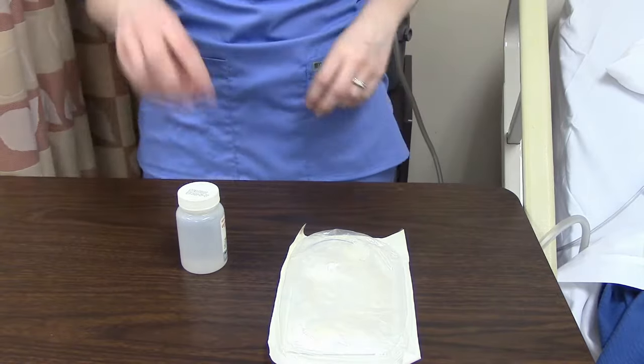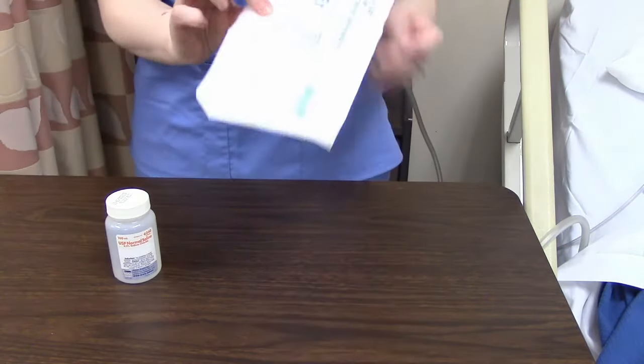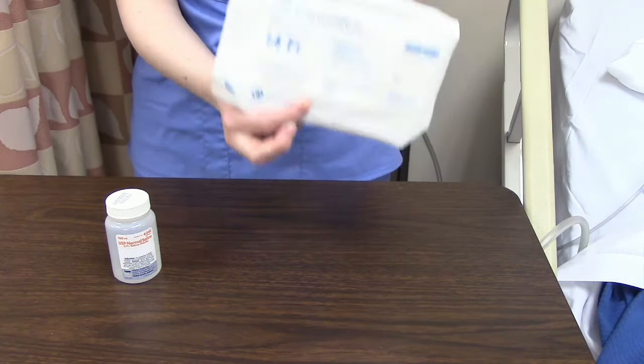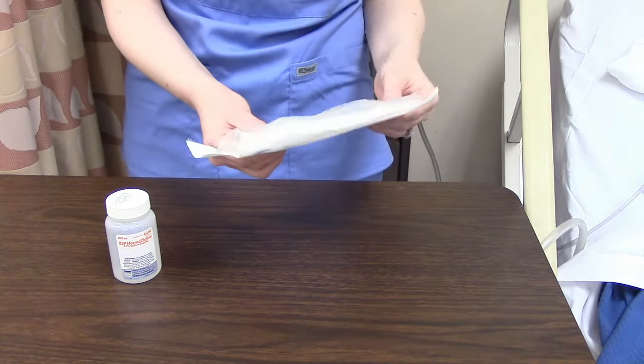The supplies for this are a little bottle of normal saline and a trach suction catheter kit. This contains all the things we need: our gloves, our suction device, and a little box. So let me open it.